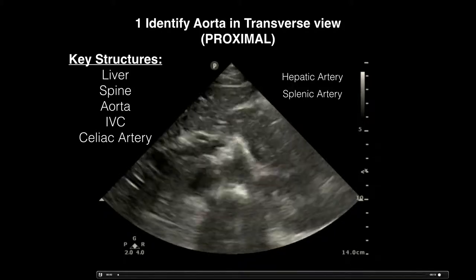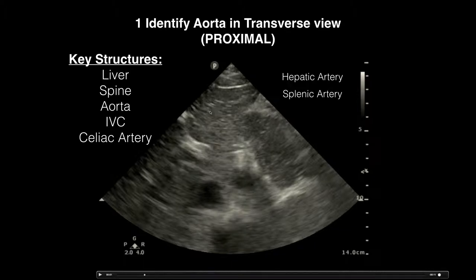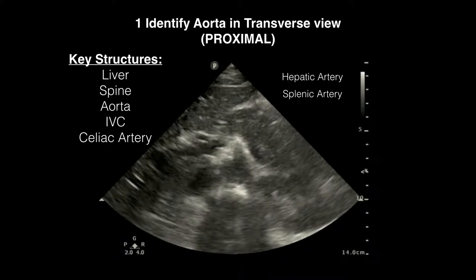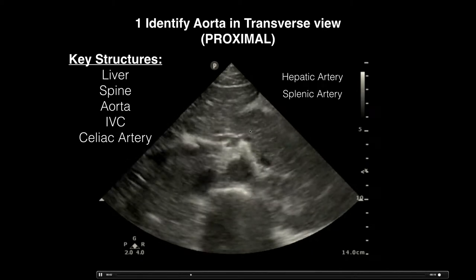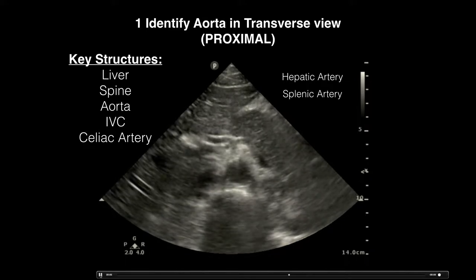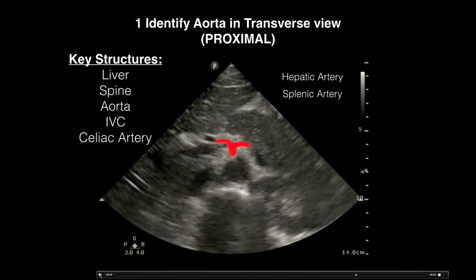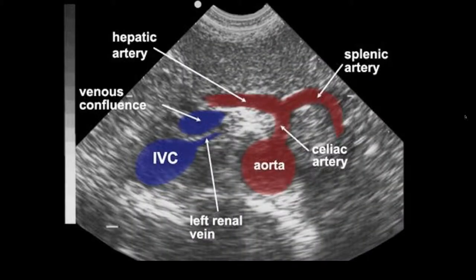As you scan through, the IVC will be towards the left of the screen. You can see the aorta branch into the celiac artery, which then becomes the hepatic artery and the splenic artery — this is sometimes called the seagull sign because it looks like a seagull. On the static image you can identify the aorta, celiac artery, seagull sign, hepatic artery, splenic artery, and IVC.